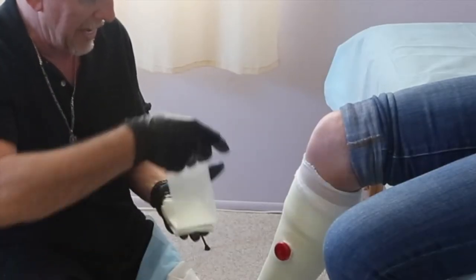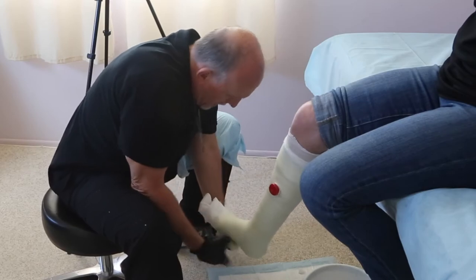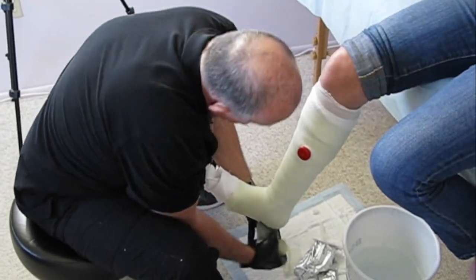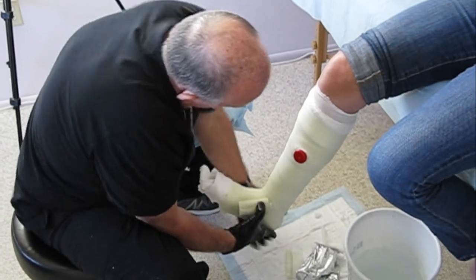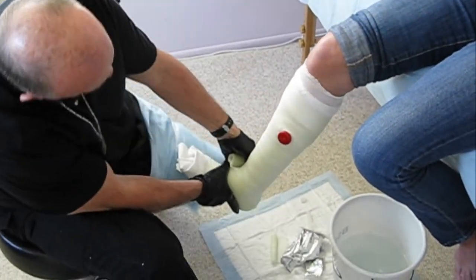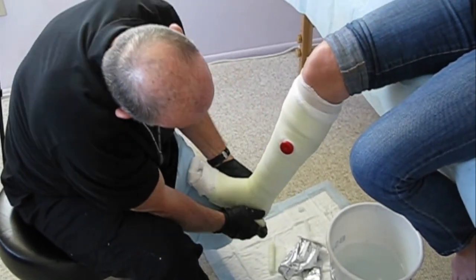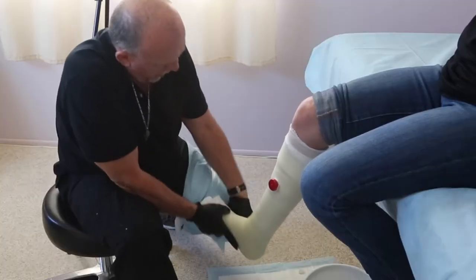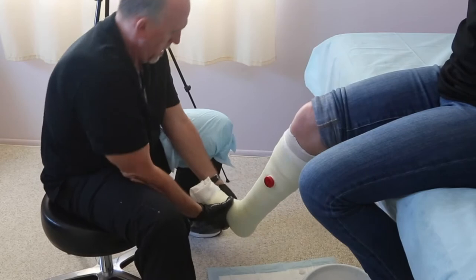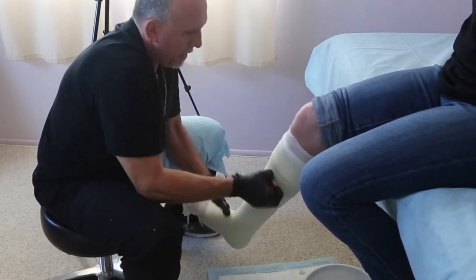It won't jeopardize the injury or the surgery because the cast didn't hold up. I will fan fold — I like to fan fold eight layers. Connect those dots under there, just behind them, and capture it. And fan fold the heel area, four or five layers there. Reinforce the foot and ankle area. Then do your molding: the arch, the Achilles — get that in contact.